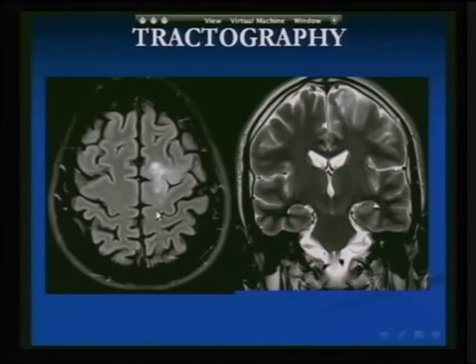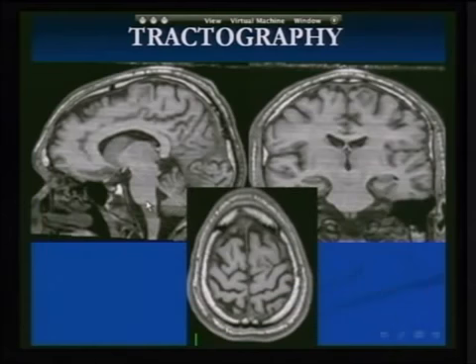Why is he asking this question? Because if the tracts are anterior, he can attack the mass from the posterior aspect. If the tracts are displaced posteriorly, he can attack the mass from anterior. The first thing is to perform a 3D gradient thin cuts and to perform reconstruction to see the lesion. Here is the lesion on the coronal, the lesion on the sagittal, the lesion on the axial.